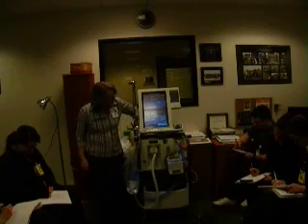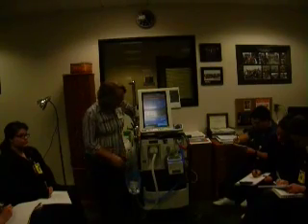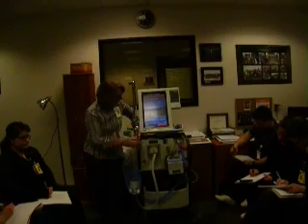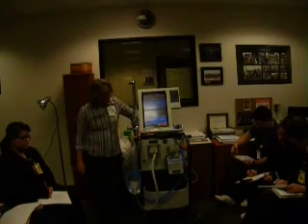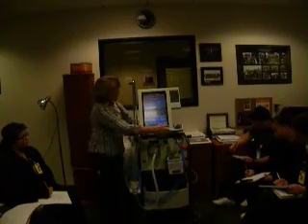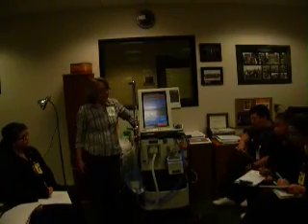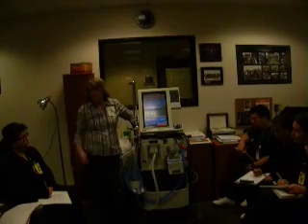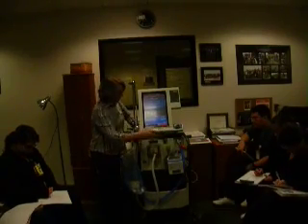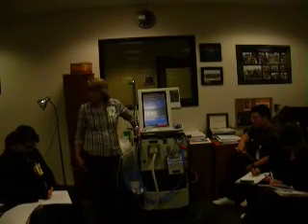And then we're going to have new patient setup. And from here we can set our initial mode that we want our patient to be in. So we have a place for vent type, and that would be invasive or non-invasive. Once you touch it, it turns orange, and then you turn your dial, and it could change to non-invasive. No one uses the vents for non-invasive. They all have the option, but we don't use it. So that vent type on this one needs to be on invasive. So you turn your dial back to invasive. But if push came to shove, you can use that.